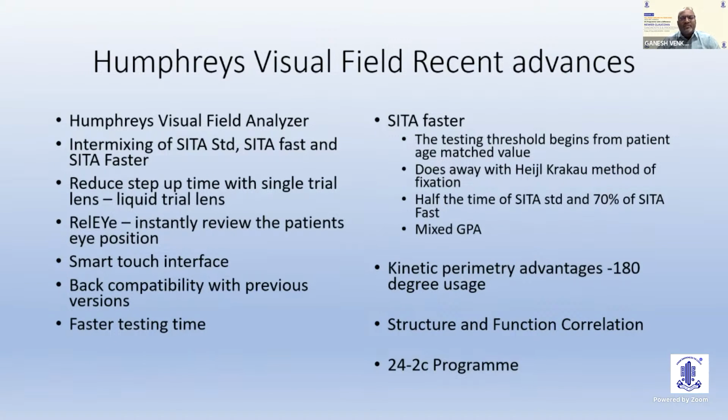Coming to the visual field, Humphrey, the recent advances include the intermixing of the SITA Standard, SITA Fast and SITA Faster. And there's a reduced setup time with a single trial lens. So you don't have multiple lenses there.